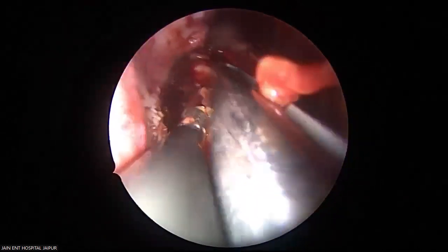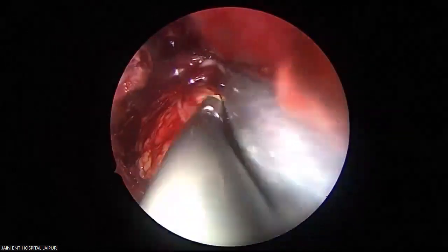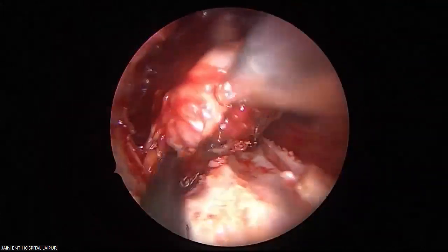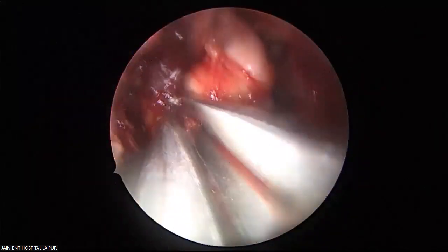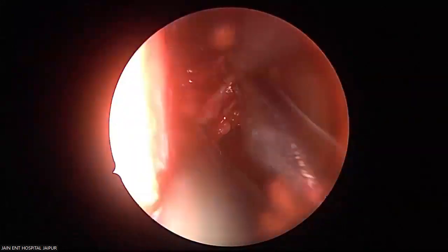See, that's the tumor lobulation. And what I'm separating is the surface structure. See this? This section with the coblator only. Advance more and more. Pull it. Okay.